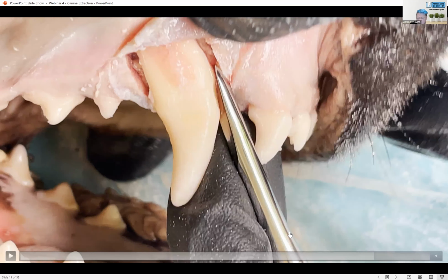And another thing that I'm seeing here as well, Beck, you've got your fingers nicely placed right close to the end of the working point of an elevator. So if you slip, you're hopefully not going to go too far into the animal. Yeah, no eyes, no noses. And also, I guess it's a modified tennis grip, so you've always got your finger extended down the shank of the instrument. And again, right there, I'm using it as a bit of a finger stop as well, to help stabilize my hand as I rotate. And as we've all been taught, and probably don't do very well, the key to your elevation and luxation is, once you've inserted the instrument, you rotate and you hold for 10 to 15 seconds.